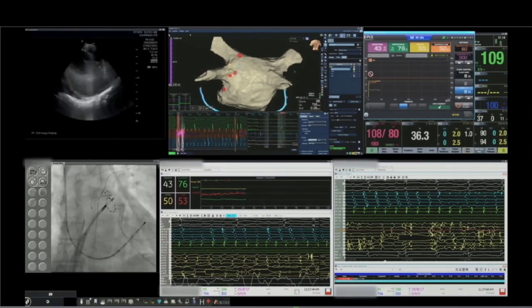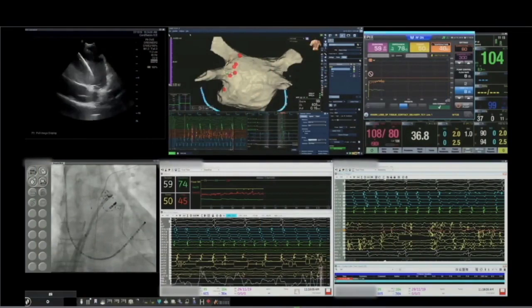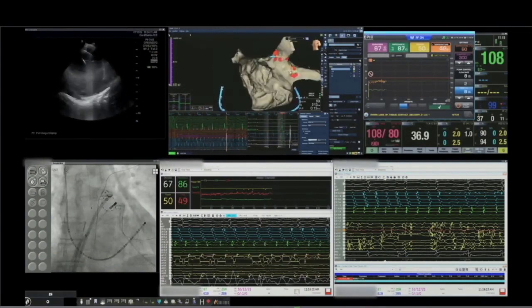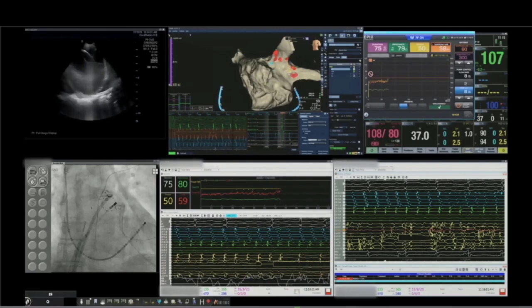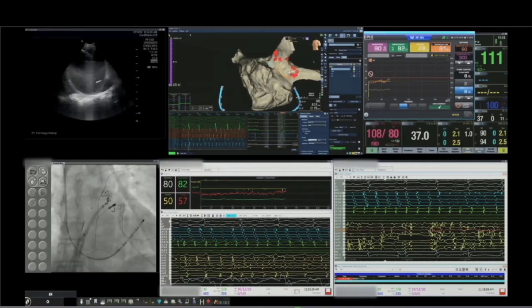Sorry to interrupt. For people that are not familiar with the DiamondTemp screen, so you're burning here. Can you show what is the temperature that you have and how the power changes according to the tissue temperature? So as I mentioned earlier, you can kind of see this screen up here where my arrow is. And you can kind of see there it's 45 degrees. I get better temperature. It gets into the 50s. There I'm on the ridge, hits 60 degrees. There's the power. So you can kind of see how much power. It looks like duration, and there's my impedance change right there. And so you can kind of see, again, hitting 55 degrees, 61 degrees.